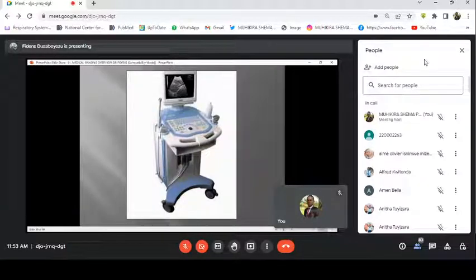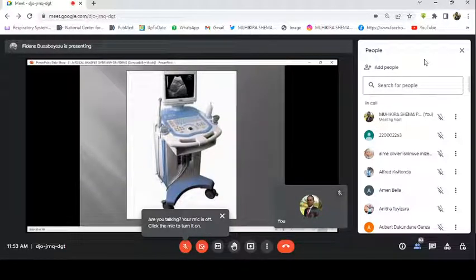You can say this patient has this and this and this before even you do a report, before you look at the images afterwards. It's a real-time examination and it is cross-section imaging.